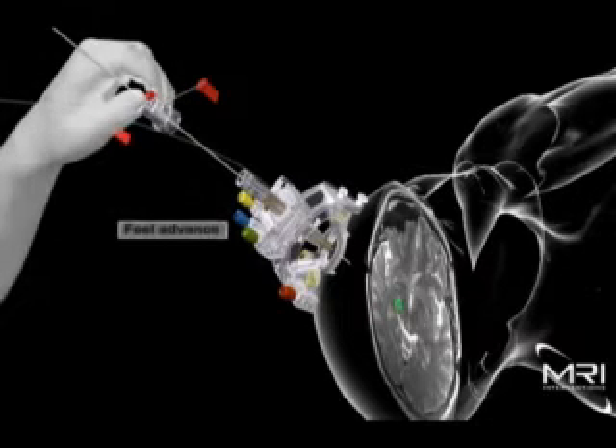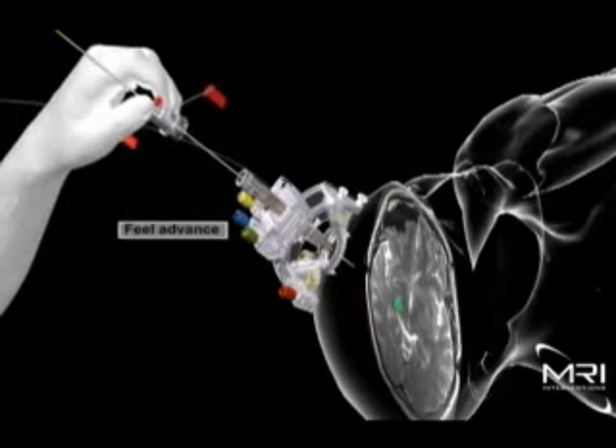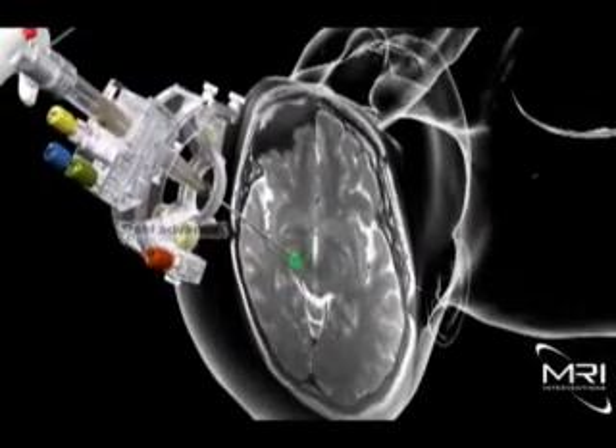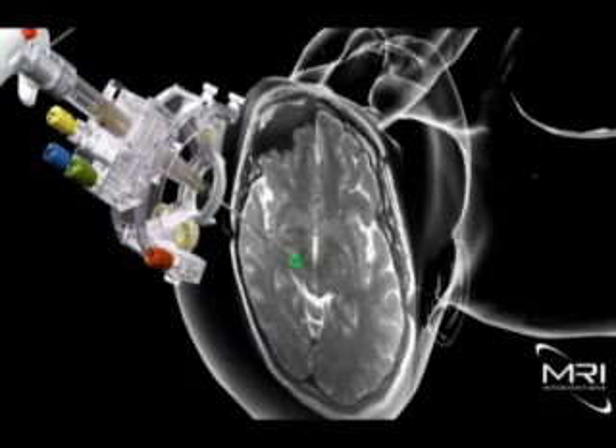With the smart frame now properly aligned, the surgeon can insert the interventional device through the center lumen in the trajectory frame. As the device is advanced, the surgeon observes real-time images to verify that no undesirable events have taken place, such as hemorrhage, and to confirm that the desired neurological target has been reached.